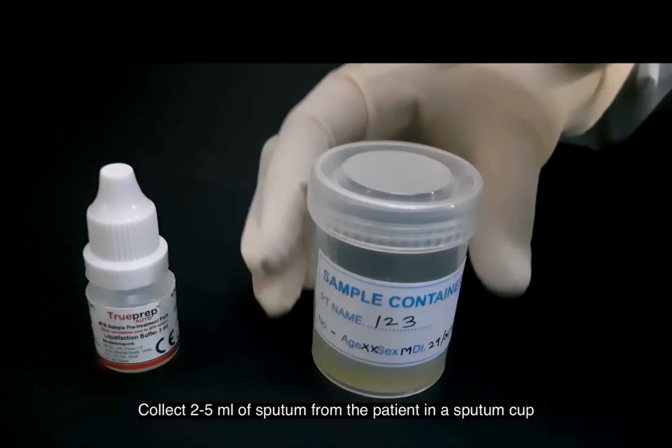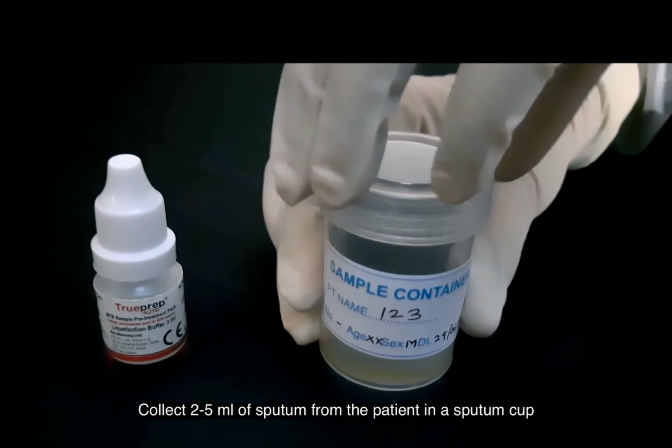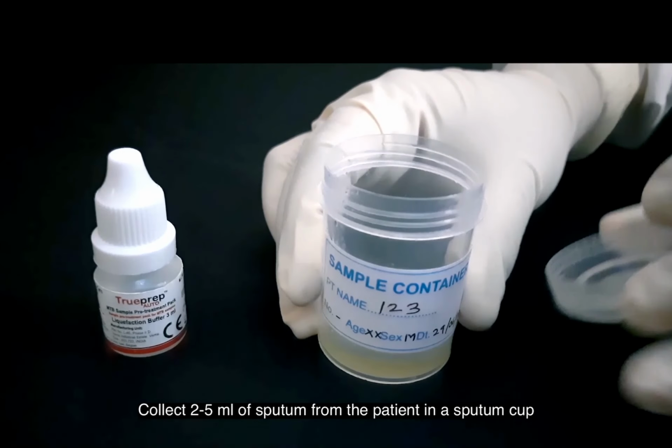Now, how is a sample processed in TrueNat? TrueNat sample processing. First, sample pre-treatment. First you have your sputum container. You have taken the appropriate amount, 2 to 5 ml of good quality sputum. You open the cup. Obviously, as we discussed, you have to prepare the workbench and wear your PPE, everything. Then only you start doing this.